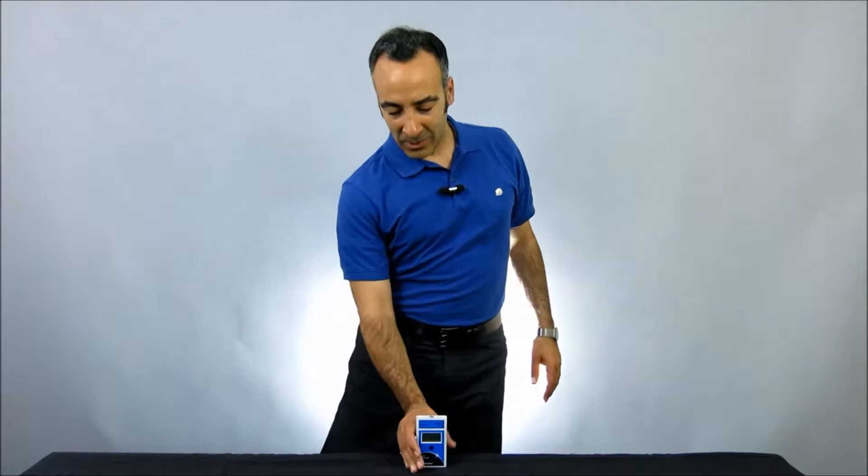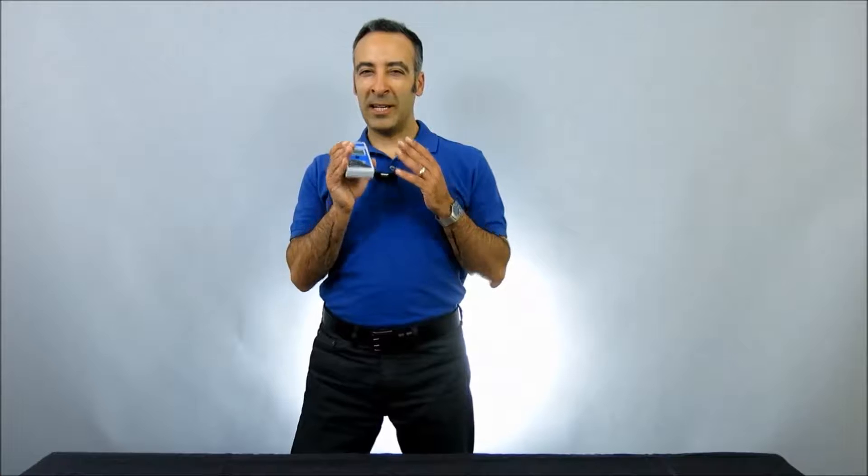Hello, I'm Moshe Levy, Vice President of Marketing at Solar Light. Today we're going to be taking a look at our Solar Meter Model 9.2 Bilirubin Radiometer with Integral Sensor.